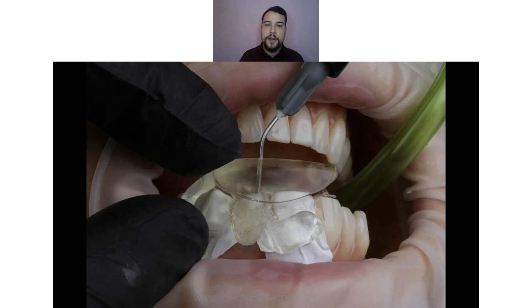Here we have transparent silicone, which is cut following the gingival margins. Don't get confused by this curvy line. This is just the impression tray line, but actually the transparent silicone is cut following the gingival lines. This is also one of my modifications of this technique, because I want the margins or the edge of the silicone index to follow my margins.